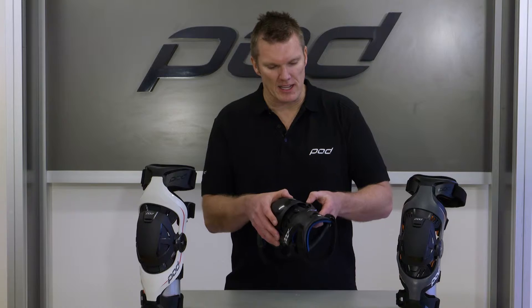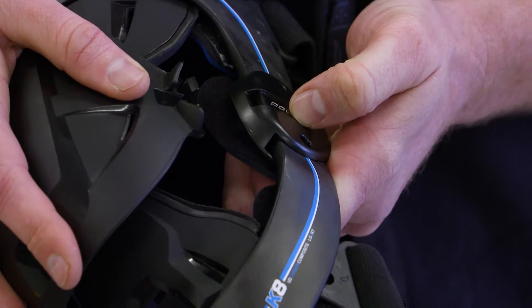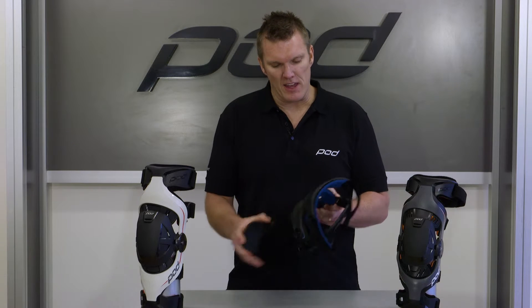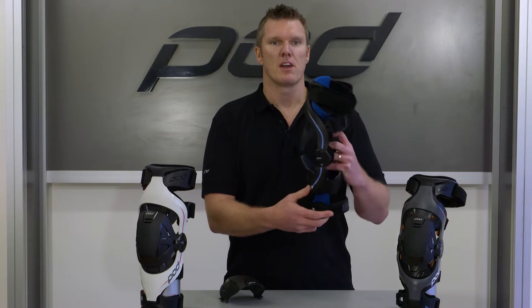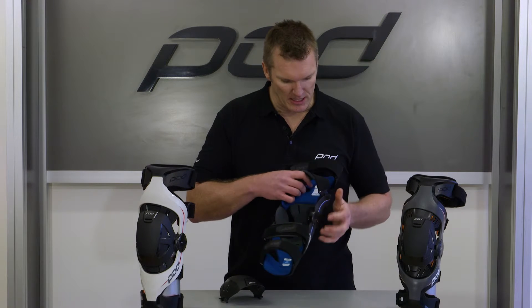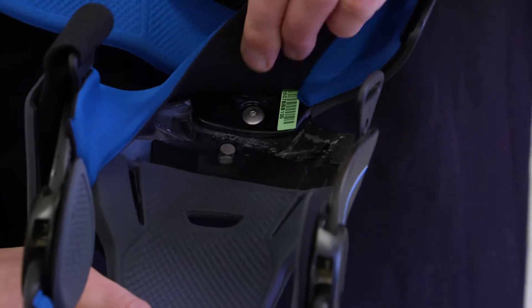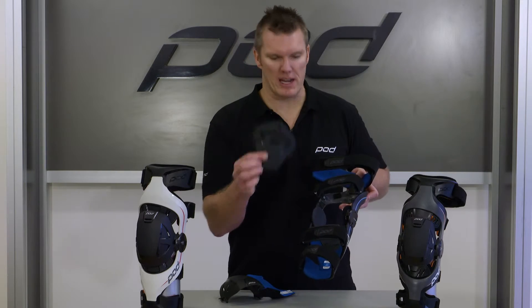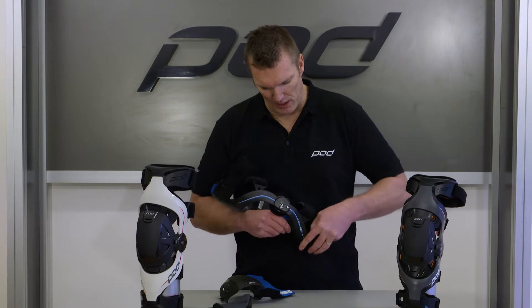To remove the Patella Cup, push down on the tab — it pops out — so you can do that quite quickly on both sides. Now we're left with the upper and lower impact protectors. Turn the brace around and underneath your padding — which I'll take out right now — there's a post. You can snap the impact protector up and it comes straight out, and you can do the same on the lower frame as well.